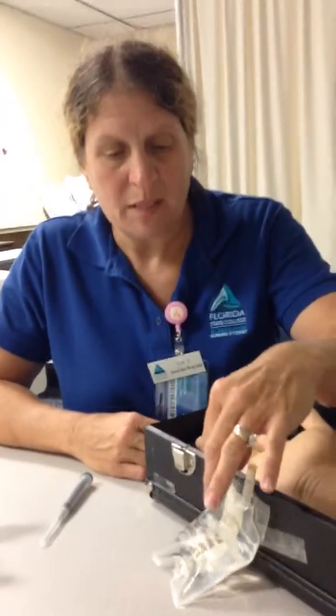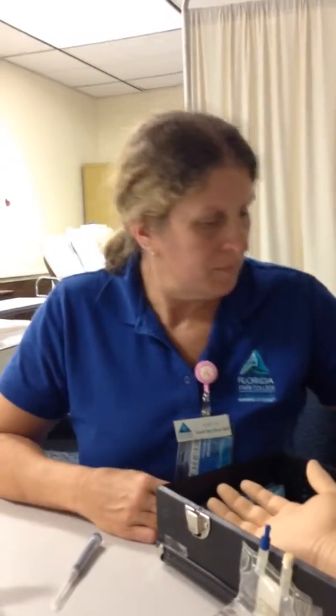My name is Kim Boothby, and I am going to be doing a primary IV is running, and I'm hanging a piggyback medicine. I've checked the doctor's orders on the MAR, and he's ordered a mini pack Flagyl. It's ordered in 500 milligrams per 100 milliliters, and it's available in 250 milligrams per milliliter. So that means I'm going to pull up 2 milliliters.